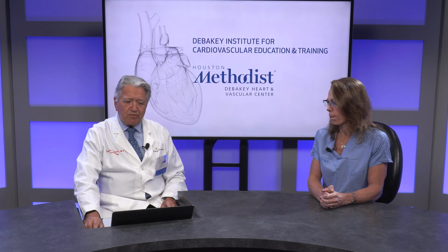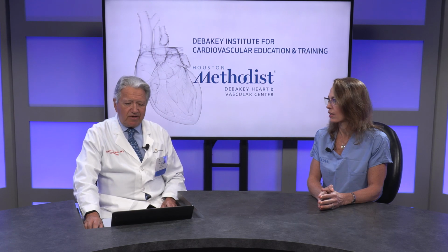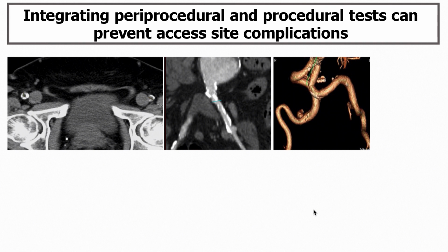Now let's talk a little bit more about integration as far as procedural and periprocedural tests that can prevent not only access site complications, but many other complications. The important aspect is to use all the modalities that are available to us, such as CT scans, MRIs, ultrasound, and so on.